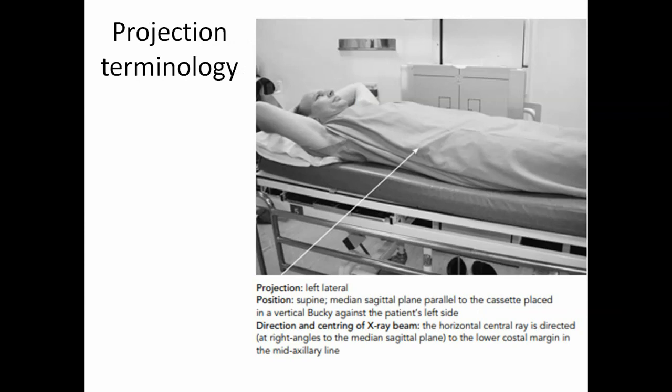There are certain other projection terminologies we also use. AP, PA and lateral is a common set of views. If the patient is stable and comes walking, we are able to take all three radiographs. Sometimes the patient comes and is not able to move, lying down, and you want to take a lateral. This is the example view for lateral radiography, left lateral radiography. Previously I said it can be left lateral or right lateral, anything.